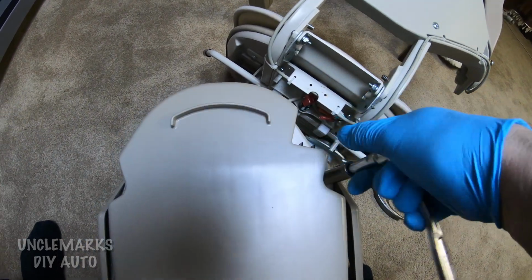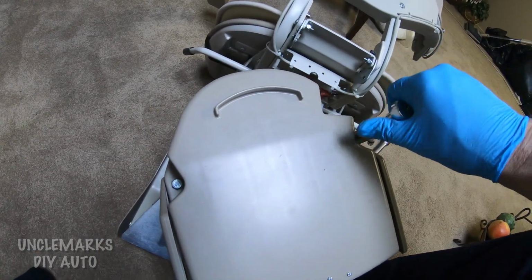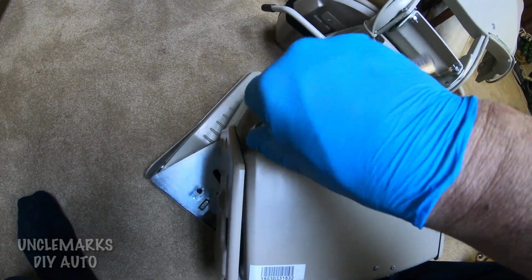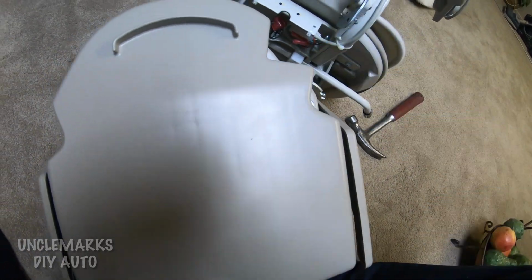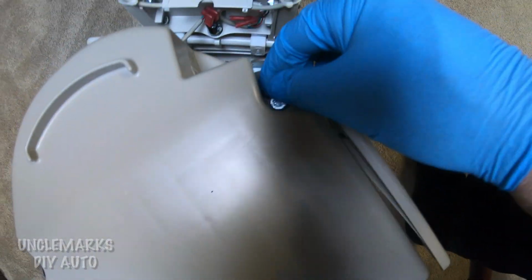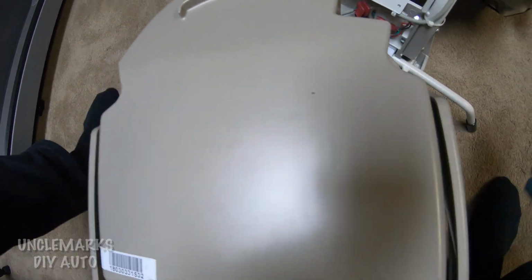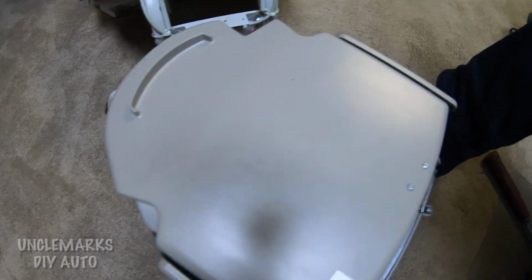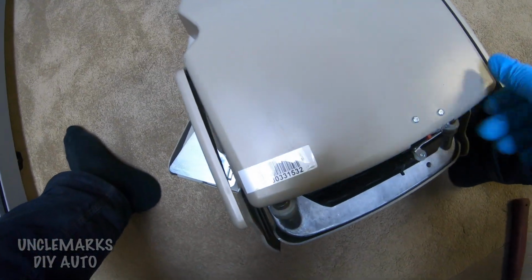Not really sure what size this was. Probably a 14 or something, 13, 14 millimeter. So I'm going to take these two bolts off here. Of course, this will be kind of between the stair lift and your wall, but this gives you a little better idea what we're seeing. Pull these two out. Man, I just didn't get them out long enough. They'll come out a little easier because they won't be laying down like that. These want to stay in the hole. So don't lose them, and this cover should come off. Put them somewhere where I won't lose them.